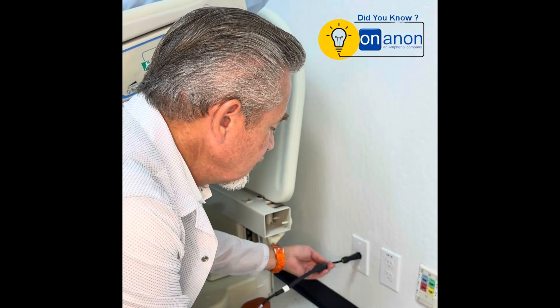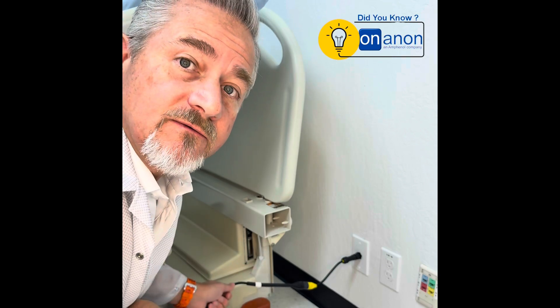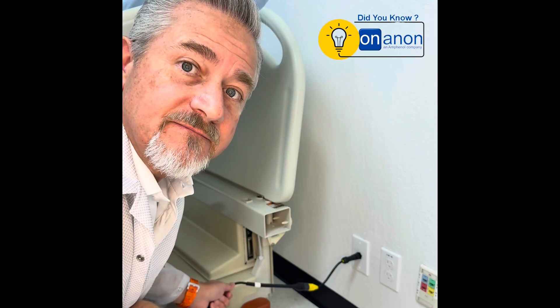Where MagConnect can solve this issue is if they forget to unplug it and they wheel it away, it just comes undone — nothing is damaged. And then the intuitiveness to plug itself back in: they just get it close and voila, it plugs itself in. So again, a very practical use case for MagConnect in a hospital situation.